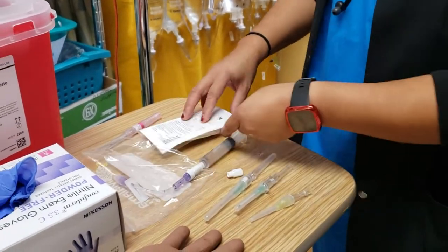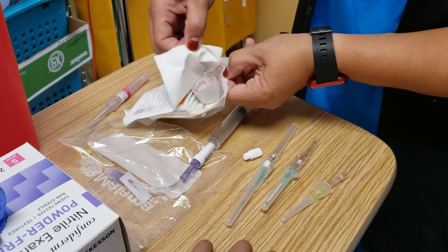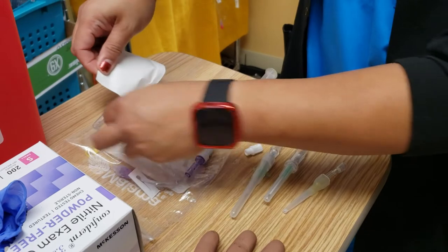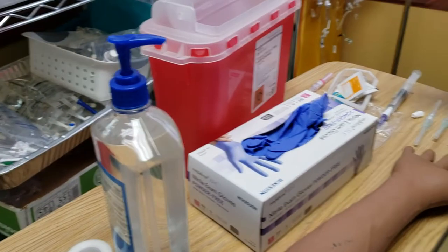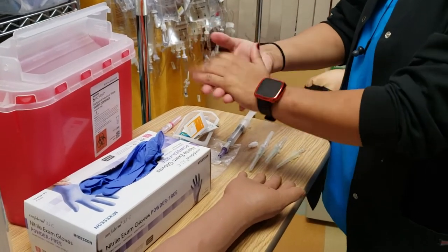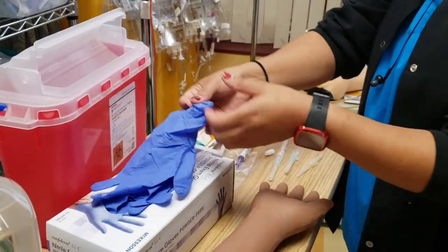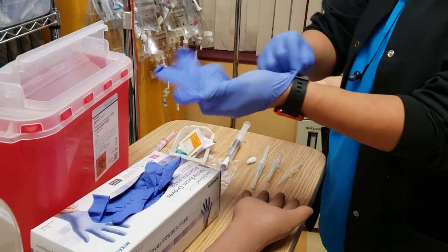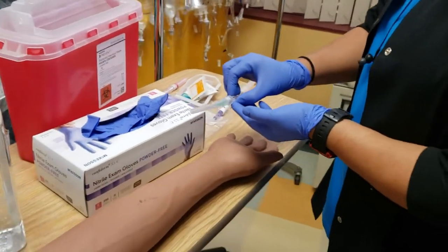Now I'm ready to do my procedure. Gel — make sure your hands are dry because otherwise it's going to be difficult to put your gloves on. I'm going to show you how to use this one first because this is the one that we have at HMC.